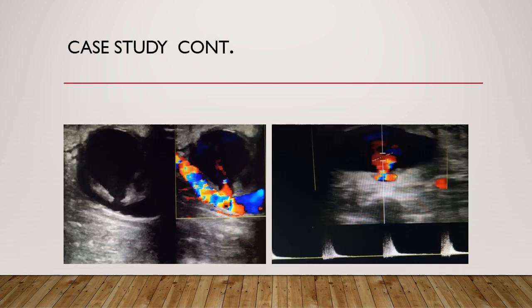And you can see again in this image here, you can see the opening, the connection there between the fistula and the pseudoaneurysm. You can see the Doppler waveform within the pseudoaneurysm also in this image. Quite an interesting case.